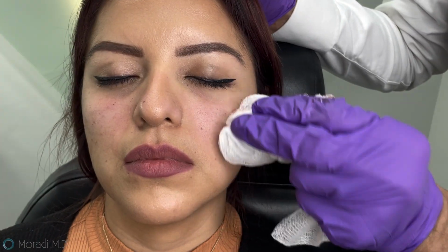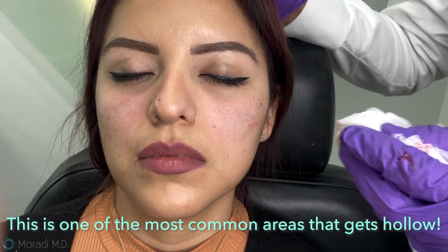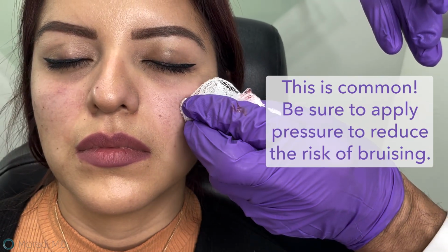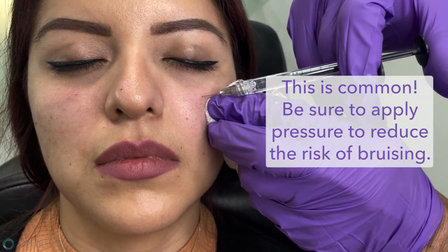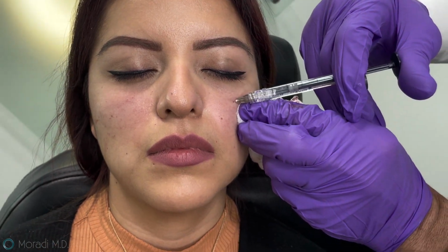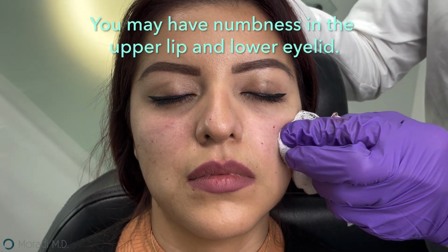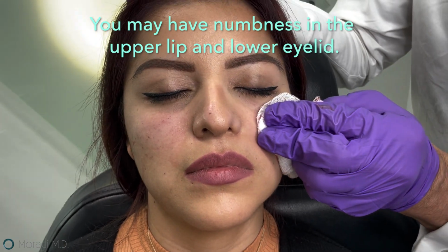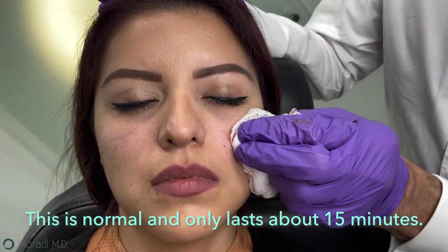The periforamen region is one of the most common areas that gets hollow. Once again, anything like that is common. Just keep pressure on the area, to decrease the chance of bruising. Once again, I'm right in the subcutaneous region. I'm close to the infraorbital neurovascular bundle. Patient needs to be cautioned that they can have some numbness of the upper lip. That's normal, and the lower eyelid, and only lasts about 15 minutes or so.